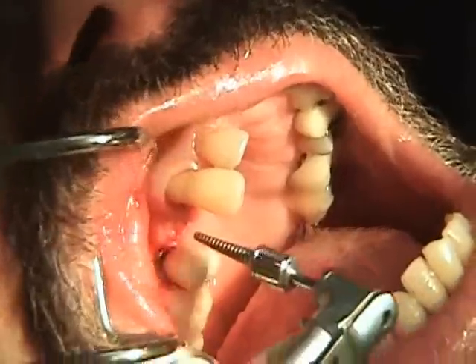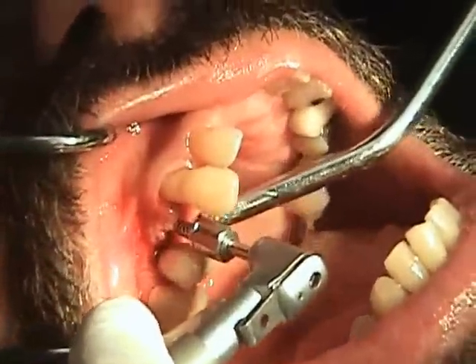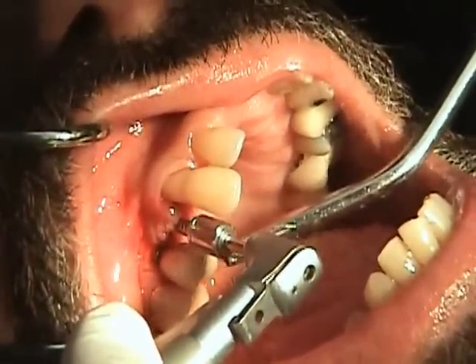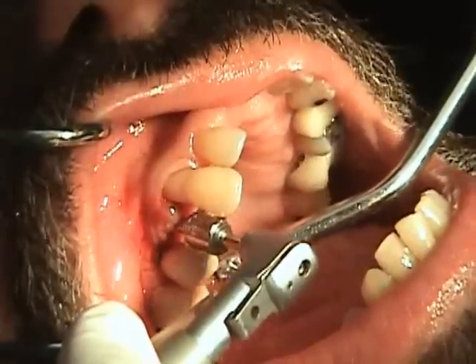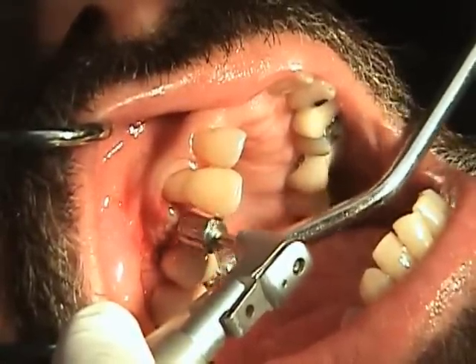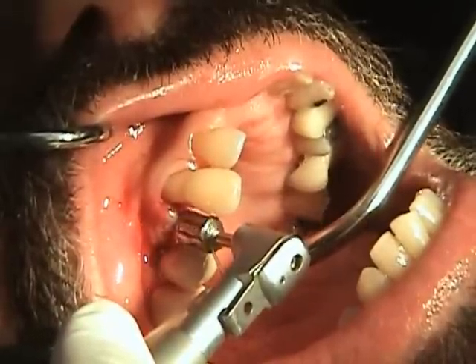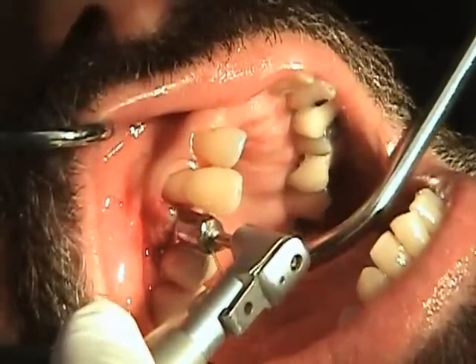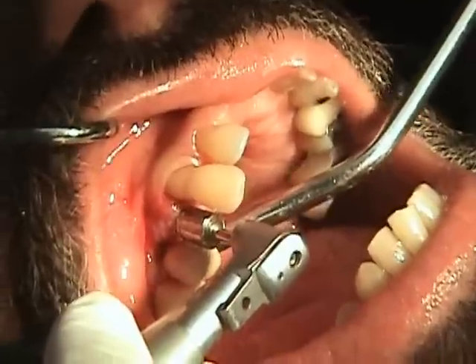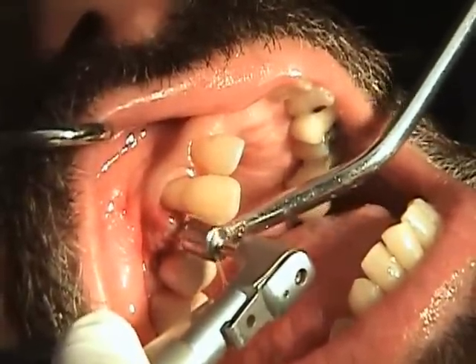The wedges are introduced by power-driven units at 55 newton centimeters. We're going to slowly tap our way in and continue widening out the ridge so it's wide enough to introduce our final drill, which would be 2.8 and then 3.5 millimeters. At 55 newton centimeters, slowly going in, and then afterwards reversing.